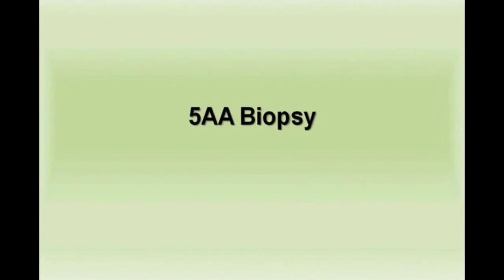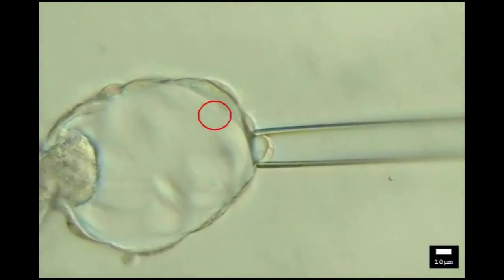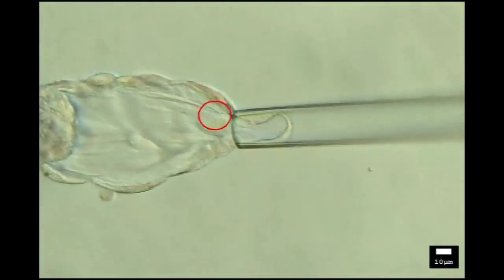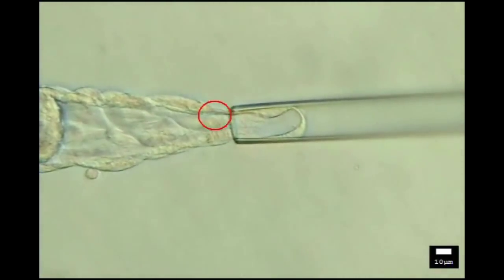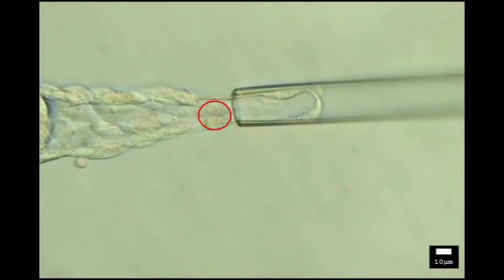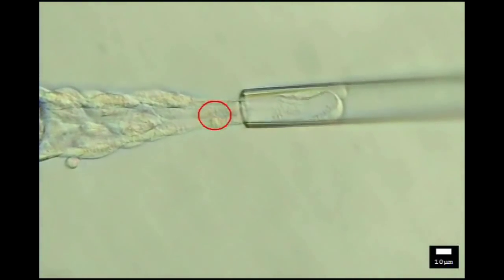A 5-AA biopsy. Note the ICM is half in and out of the zona pellucida. The first laser pulse is at one cell junction away from the biopsy pipette. Gentle pulling stretches the cell junctions and 10 laser pulses result in an ideal trophectoderm cell mass.